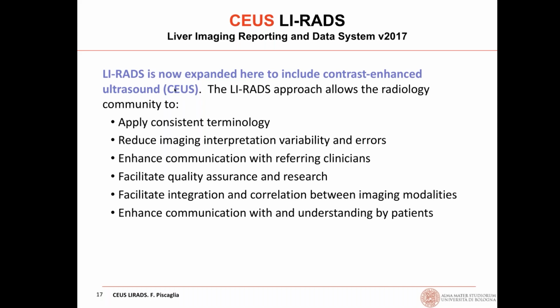And this helps also the ultrasonographers to apply consistent terminology, to reduce imaging interpretation variability and errors, to enhance the communication between ultrasound experts and referring clinicians. Sometimes they coincide, but sometimes they do not. And also the grading facilitates quality assurance and research, and integration and correlation between imaging modalities. And in the end, it enhances the communication with the patient and the understanding by patients.